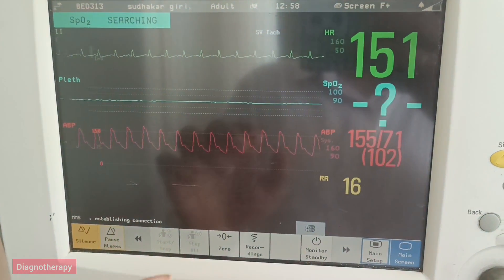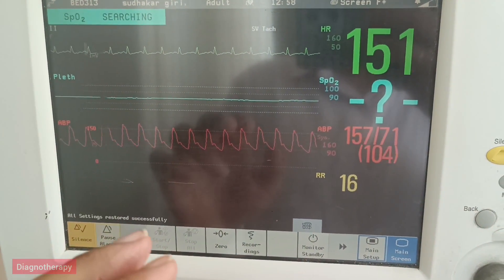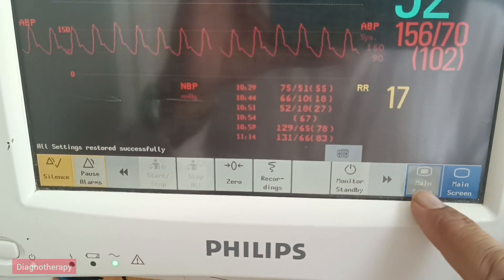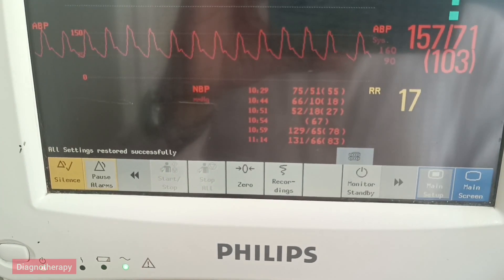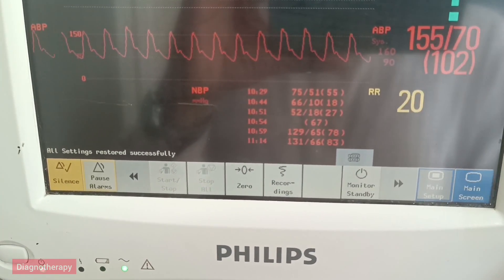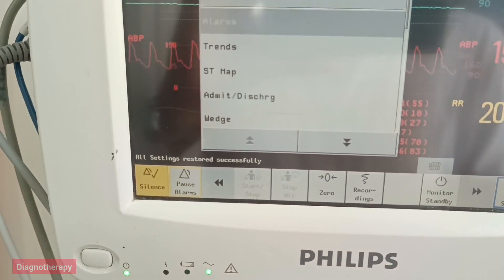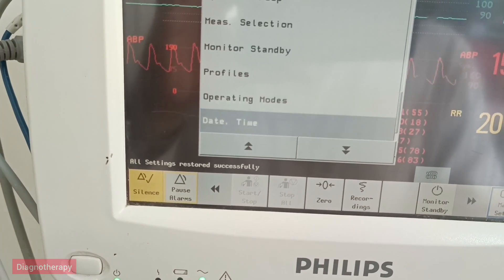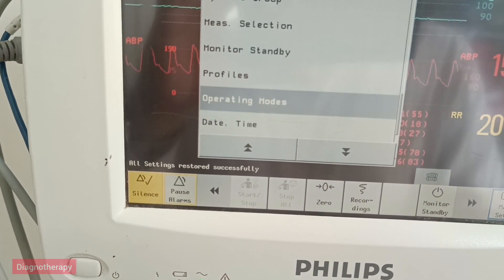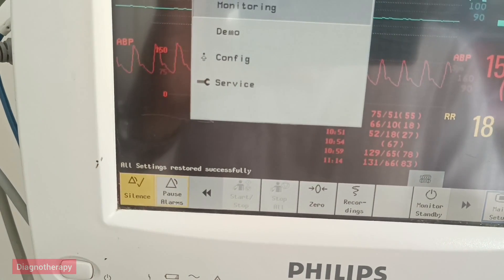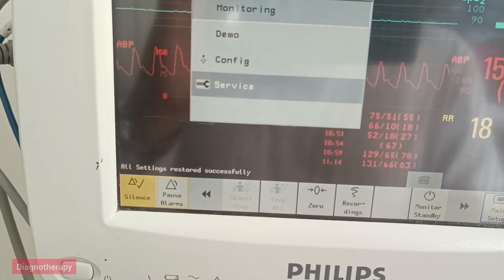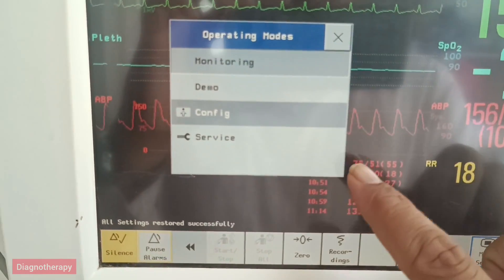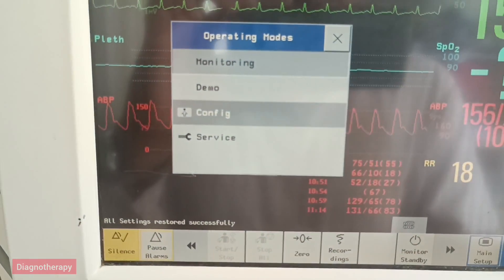For showing pulse pressure variation, we are taking the Philips MP20 monitor. Here you need to go to the main settings, scroll down and select, then go to operating modes and select operating modes. Then go to configure.